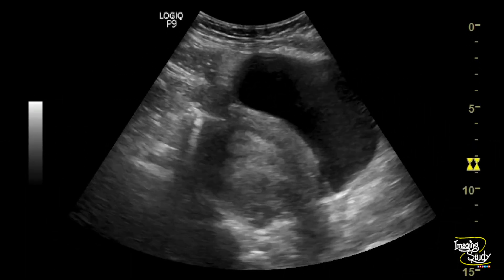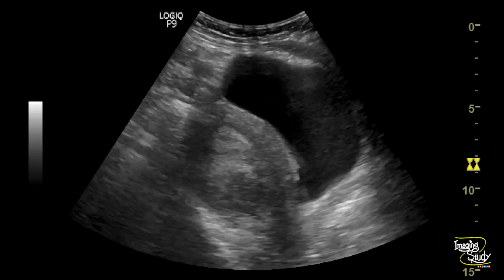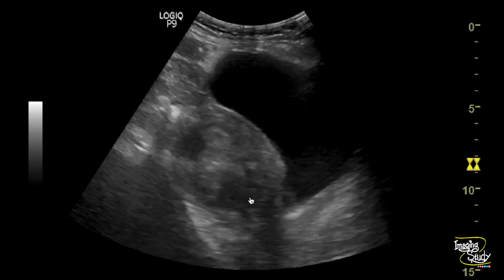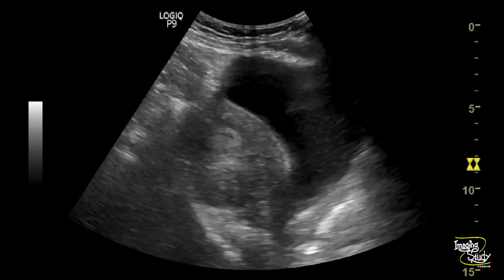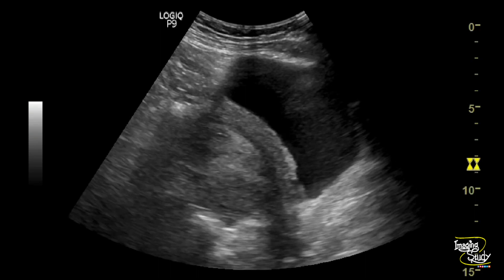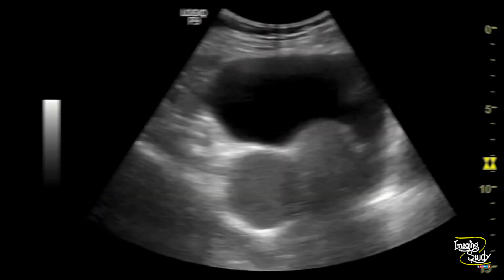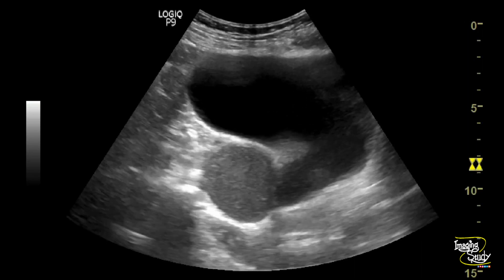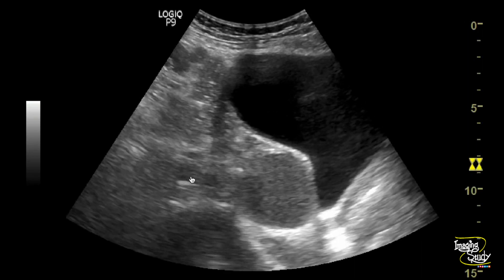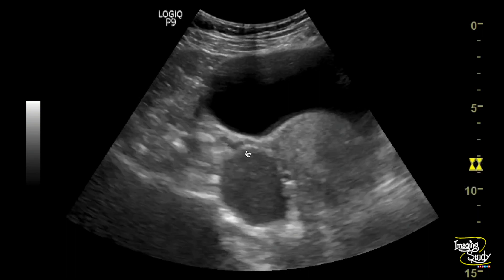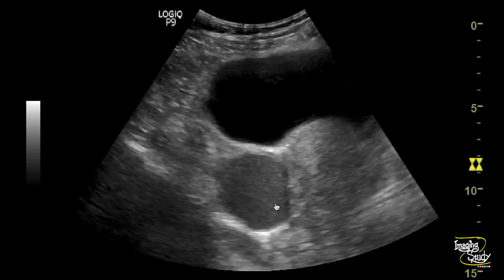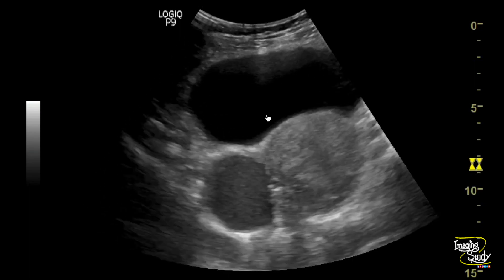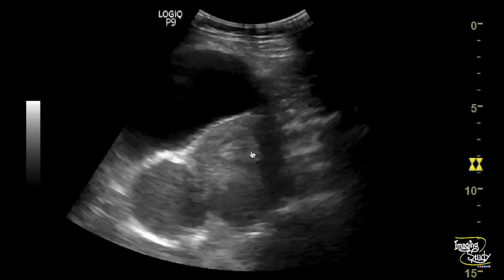Here you can see the longitudinal section of the uterus. It apparently looks normal and the size is within normal limit. This is the transverse section of the uterus, and on the right lateral side you can see a hypoechoic oval area. It looks quite homogeneous.